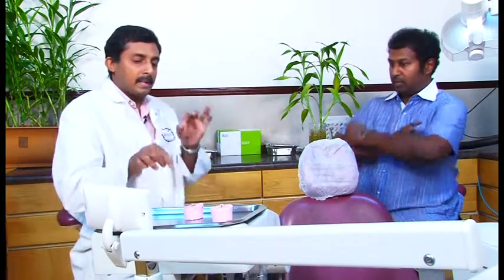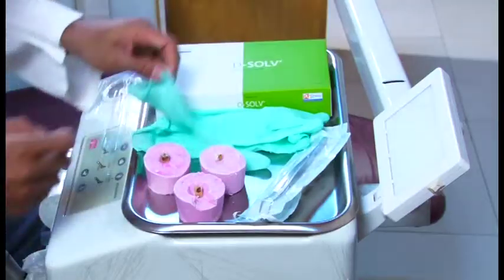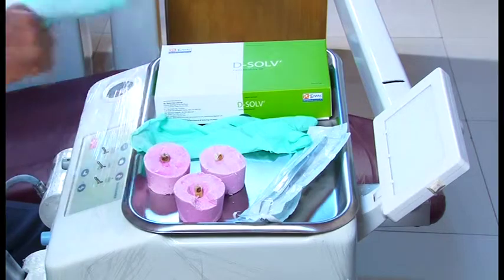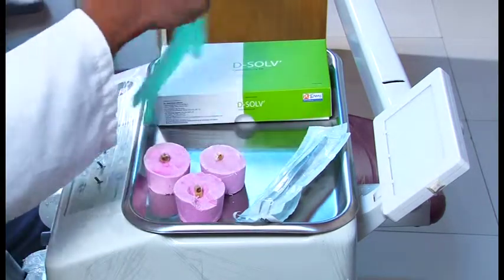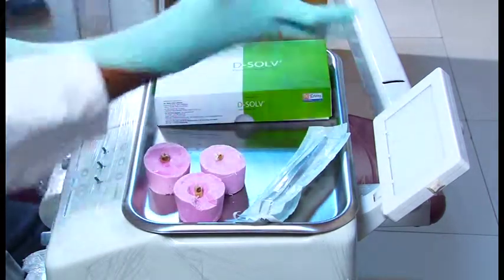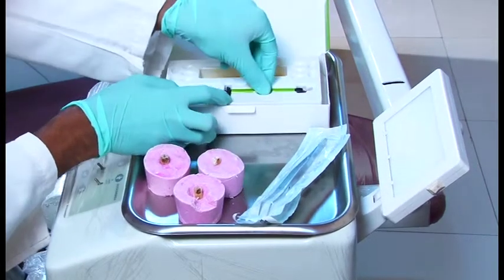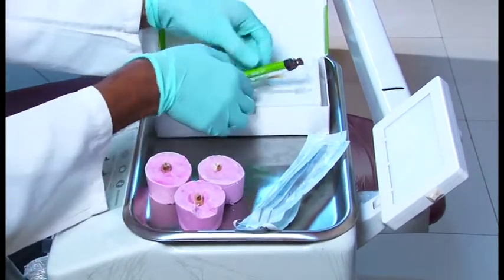I have extracted teeth here. I will demonstrate exactly how it works — in 30 seconds to 1 minute's time, I can show you how it really works. So here we have the Dissolve box. It comes as a syringe like this with two cartridges.